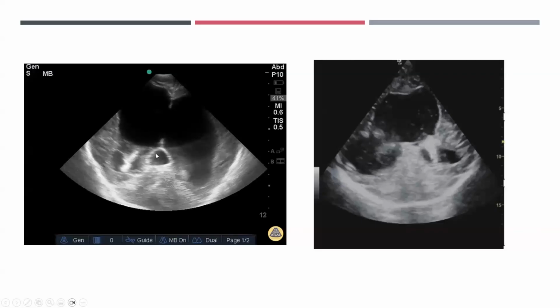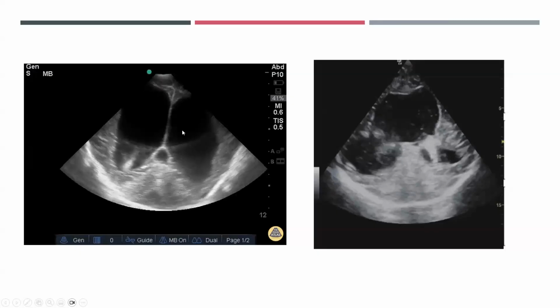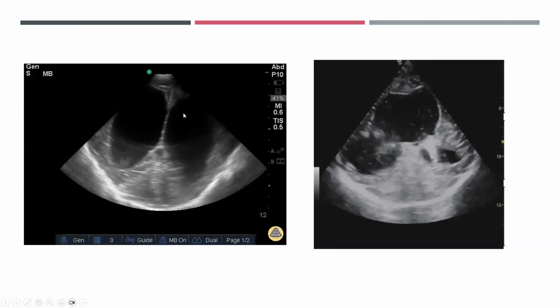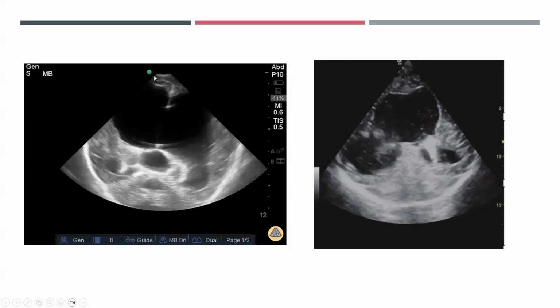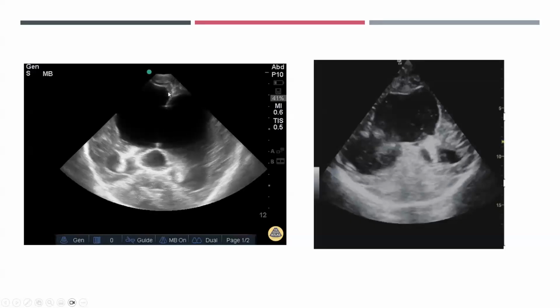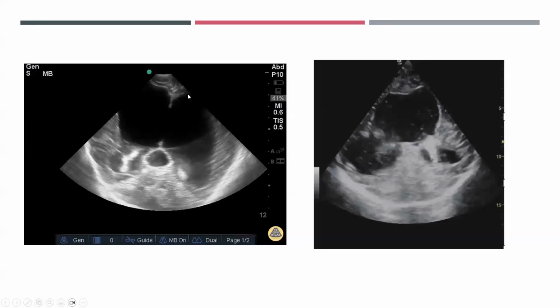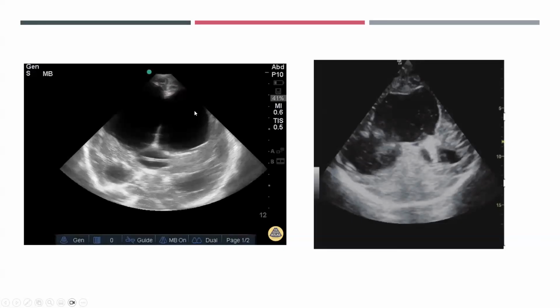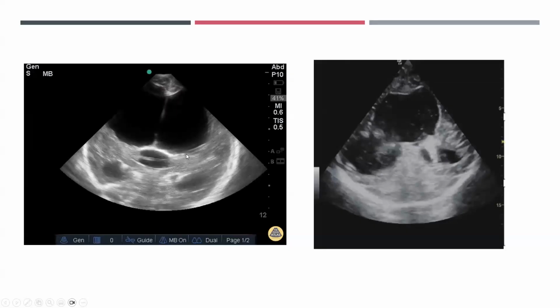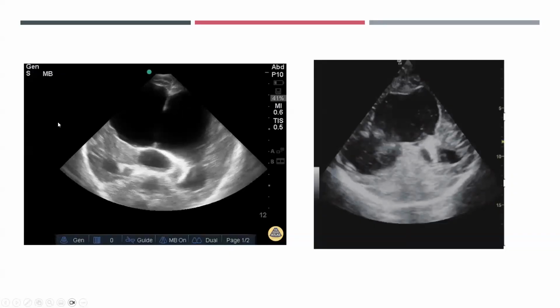As you can see, when you have hydrocephalus in this particular situation, there's a huge amount of CSF, which looks anechoic, because there's no difference in the acoustic impedance and the propagation velocity of sound waves in this area will be the same. On the other hand, reflection from the ventricular lining, because of the difference in acoustic impedance, will be higher, so that looks bright. And then at the back, again, you've got ventricular lining. So sound waves that are traveling with a constant propagation velocity suddenly encounter tissue which has a higher acoustic impedance. The difference in acoustic impedance is going to cause more reflection. So then you can see the back.